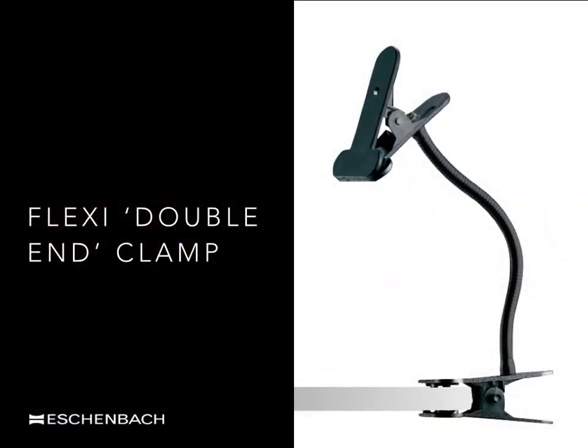This flexi double-ended clamp is another similar solution but without a built-in magnifier. With sturdy strong clamps, one end is attached to a table or reading stand whilst the other clamp is used to hold and position a handheld magnifier. The flexible stand holding the magnifier may then be moved around to assist viewing comfort of the text or object in view beneath the lens.